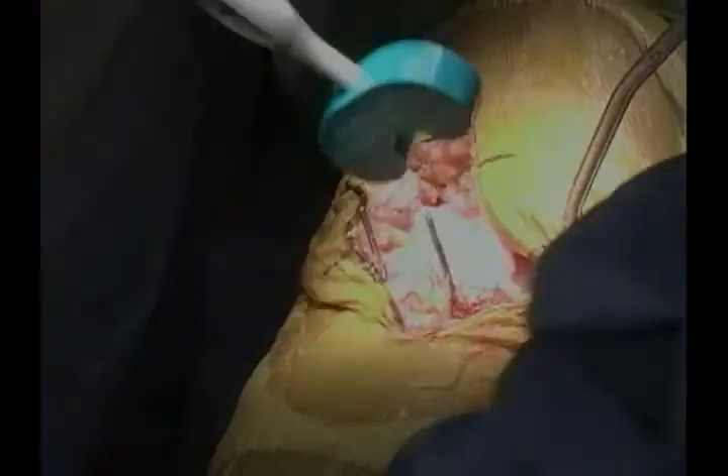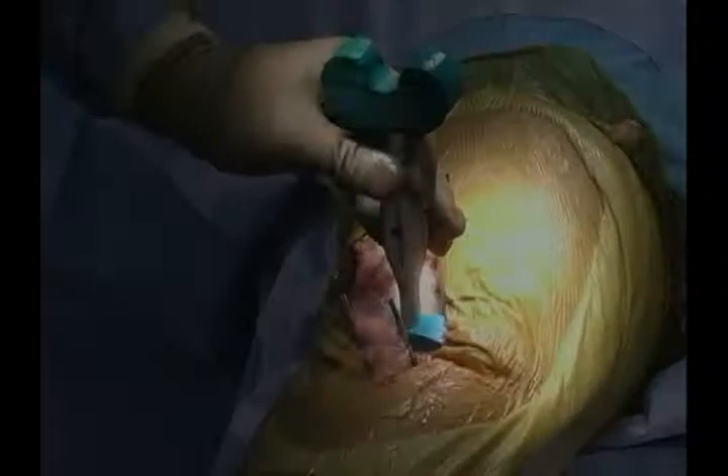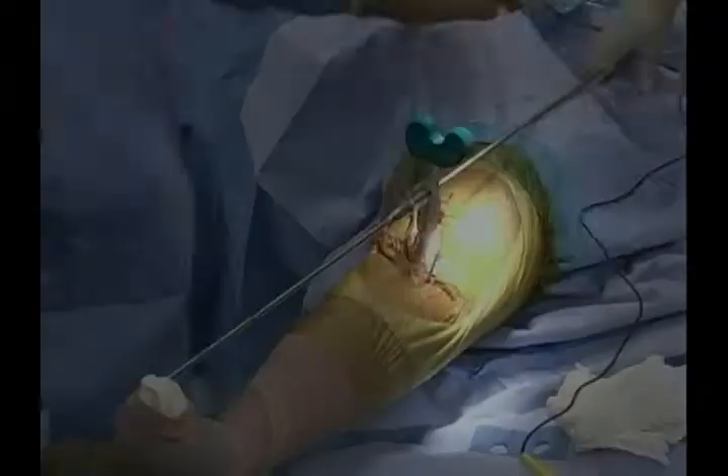Putting the spacer block back in at 10 millimeters in extension — that's much better. She now achieves a reasonable extension, and our medial and lateral sides are well-balanced. We can now assess our alignment.